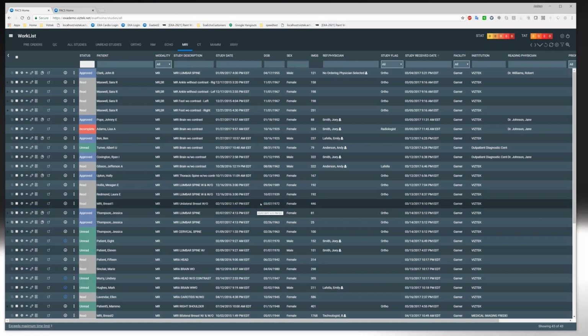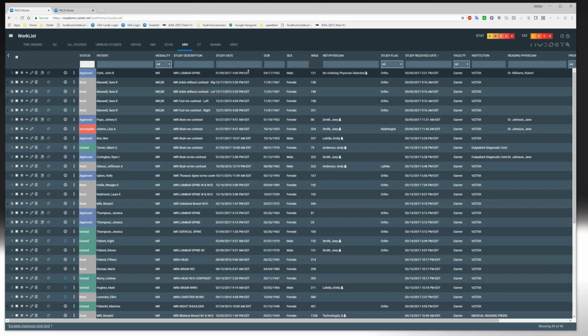The local boxes are almost analogous to the old dumb terminal idea, where the mainframe computer in the old days would do all of the work, and you would have just a terminal like a monitor with a keyboard that just displayed the pixels. That's basically what we're doing here, where all of the work that's required for image analysis and even reporting and so on is done on the server, and we're very undemanding on a local workstation.